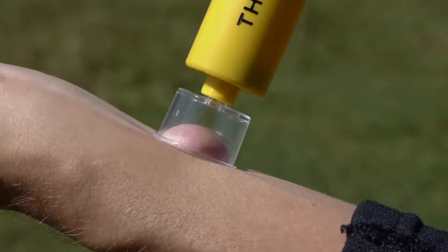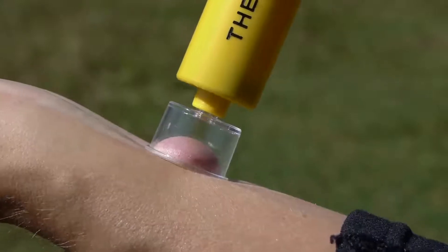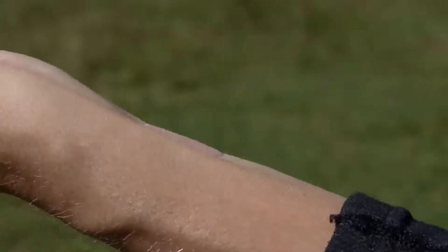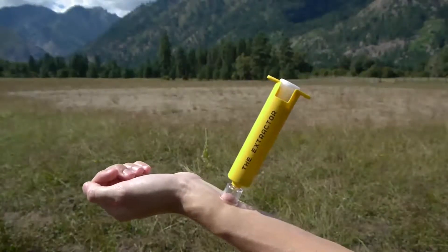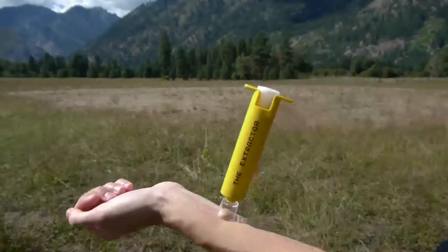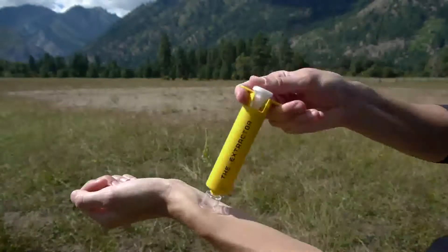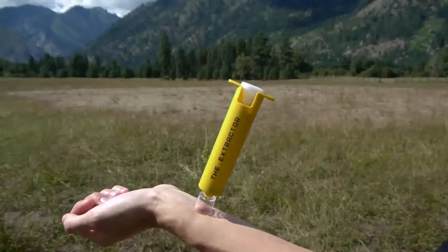This should take about 60 to 90 seconds for insect bites. Pull the plunger out to gently release the vacuum. For snake bites, center a suction cup over one fang hole at a time and alternate between fang holes every two to three minutes for 15 minutes. Discontinue use after 15 minutes.